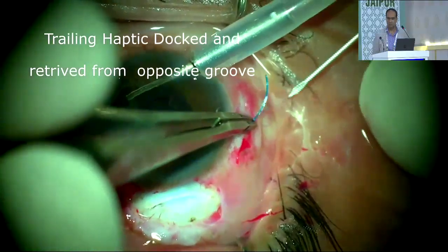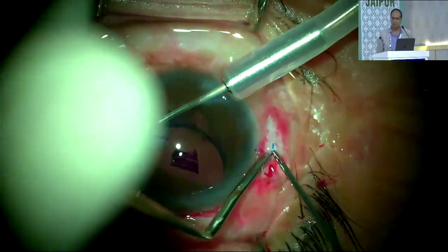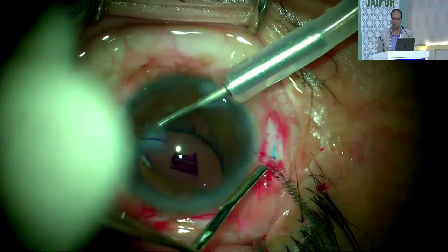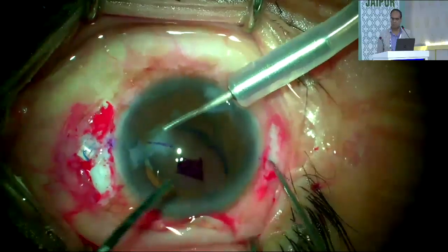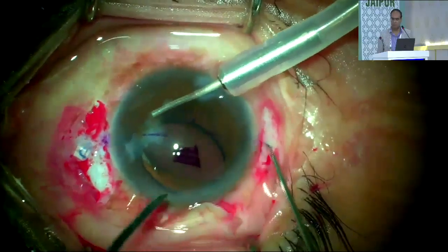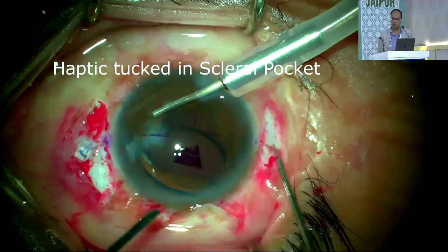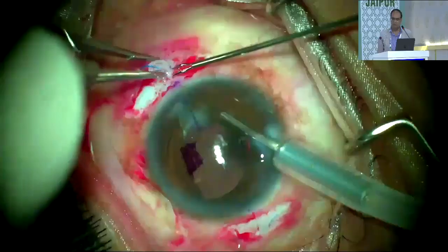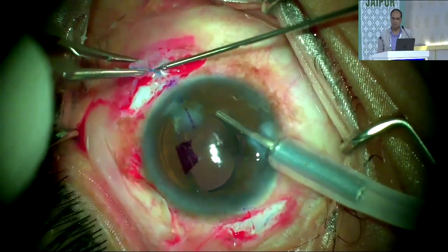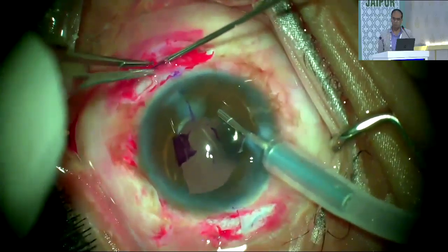After the trailing haptic is exteriorized, it is tucked into the scleral pocket. The silicone stopper is removed and the leading haptic is also tucked into the scleral pocket.